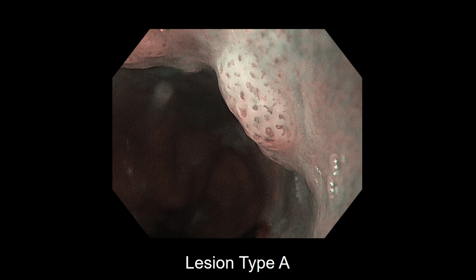Hello. Yes. Before evaluating with the magnifying endoscope, the macroscopic observation of the lesion, the first impression, is the most important. In this case, you kindly showed us the video clip, and in the video clip we found lots of nodules. So basically, we suspect submucosal cancer. After that, we perform magnifying NBI like this, and then evaluate step by step.